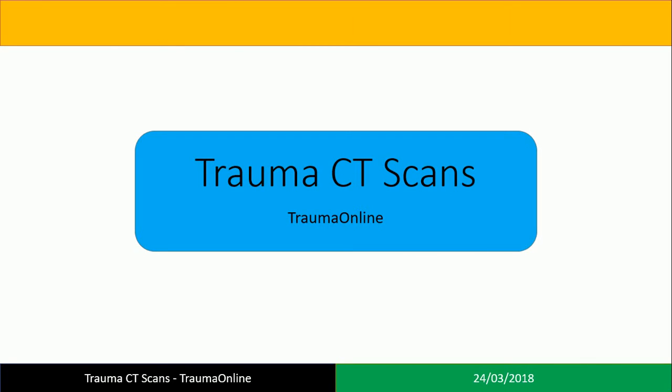Hi, in this video I'm going to be talking about the use of CT scanning in trauma. So one of the things that you have to consider is which patients do you want to perform a CT scan on in a trauma setting? And the answer is all of them, or near enough.